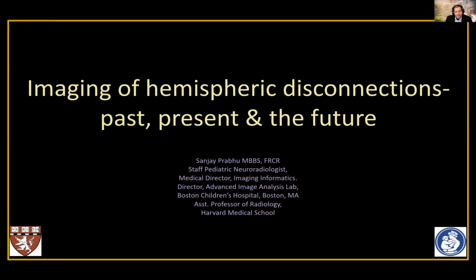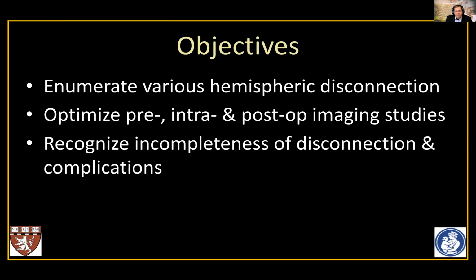The topic of my talk today is imaging of hemispheric disconnections, the past, the present, and the future. The objectives of the talk are to enumerate various hemispheric disconnections and show you ways to optimize your preoperative, intraoperative, and postoperative imaging studies designed for these patients, and recognize the incompleteness of disconnections and look at the post-op studies and recognize complications in these patients.